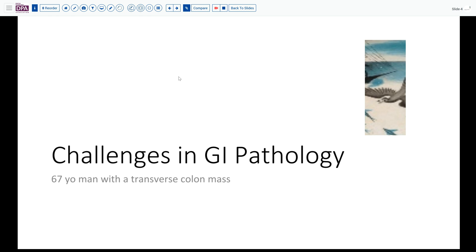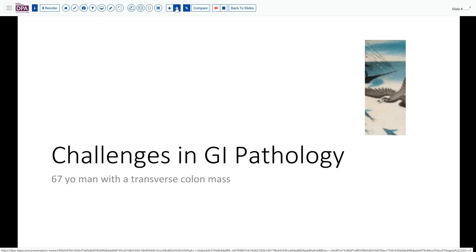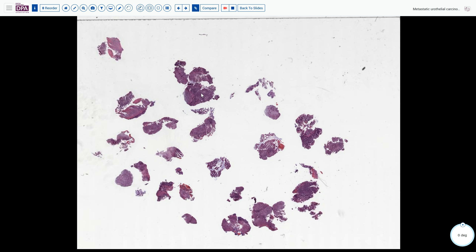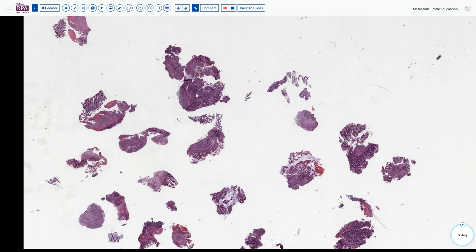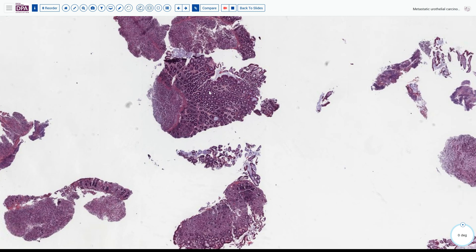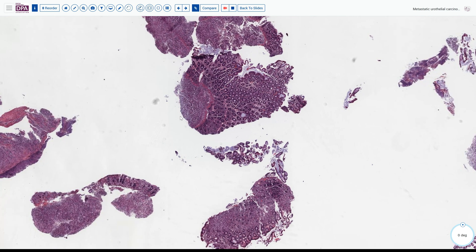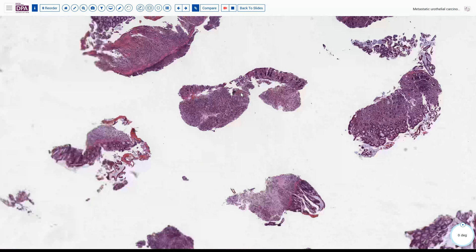Typically an elderly patient with a constricting lesion in the colon would have us primarily thinking about carcinoma. And in fact on biopsy we see multiple fragments of tumor, some benign glandular tissue, and then we note an abnormal proliferation sort of deep to the muscularis mucosa.